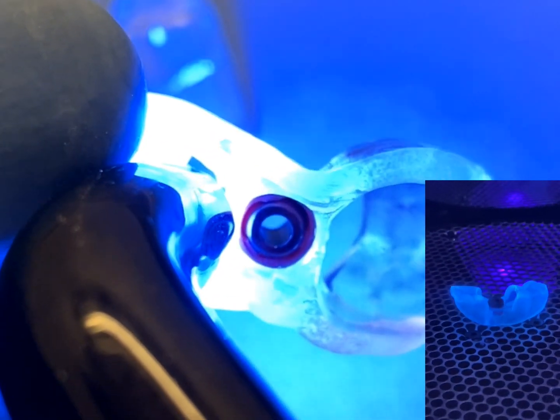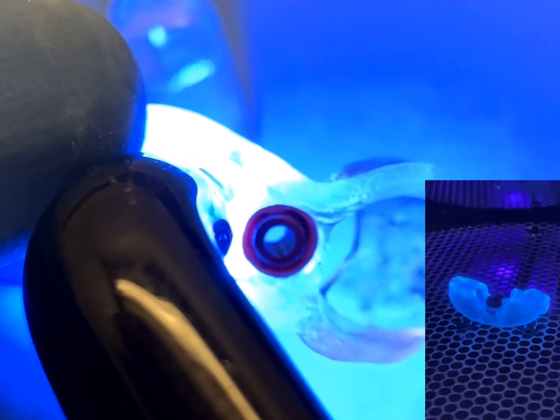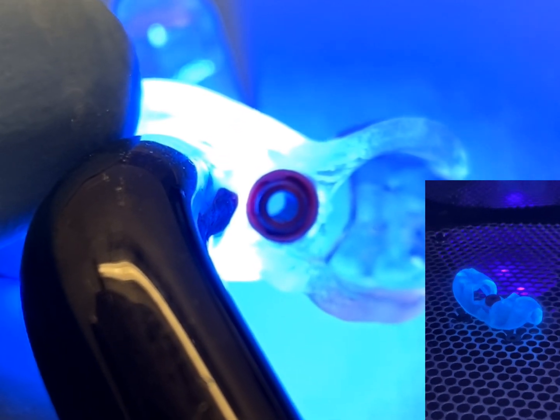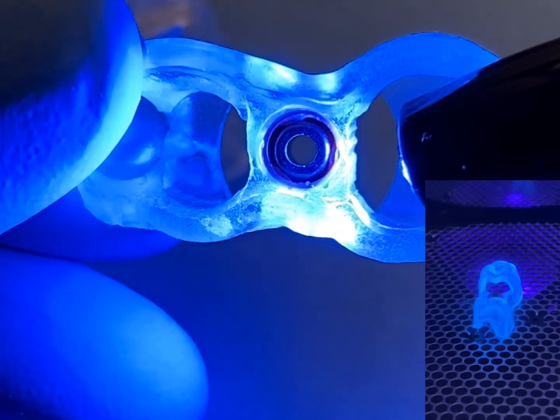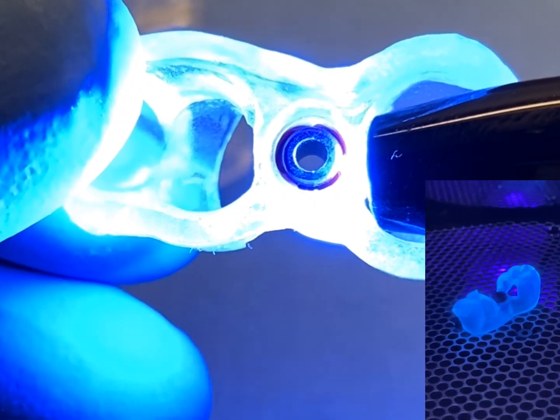Both light curable and dual cure adhesives can be used when creating a GRS surgical guide and may vary in application based on the clarity, density, and thickness of a chosen surgical guide material.